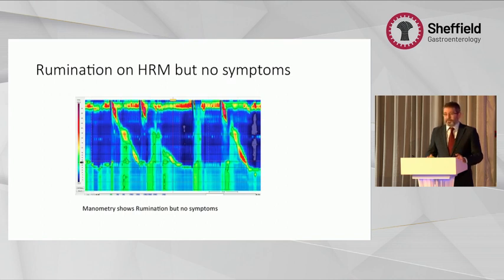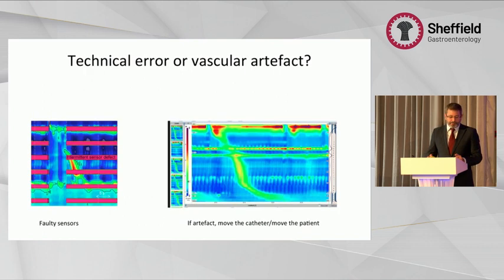The patient had cricopharyngeal dysphagia, was sent for manometry. This happened to be discovered. This was probably because they're straining. And this gives the impression of rumination. So it's important for us to really pay attention to the patients, watch their symptoms, ask them to tell you when the symptoms are occurring, and document them on the spot so that we can make sense of them.